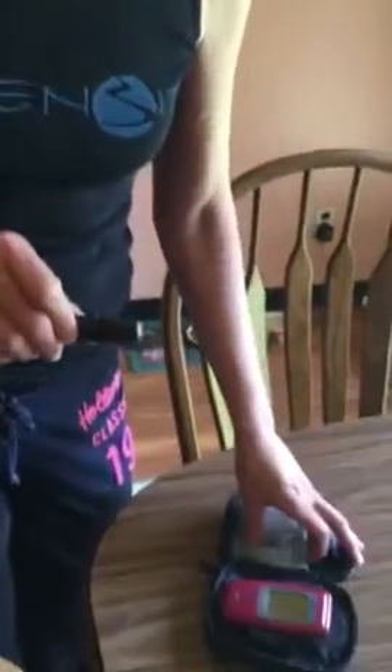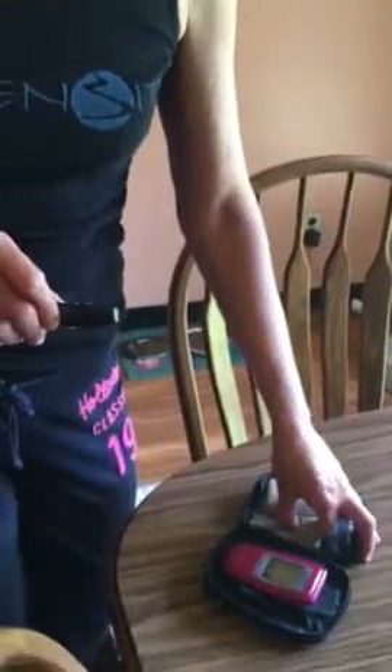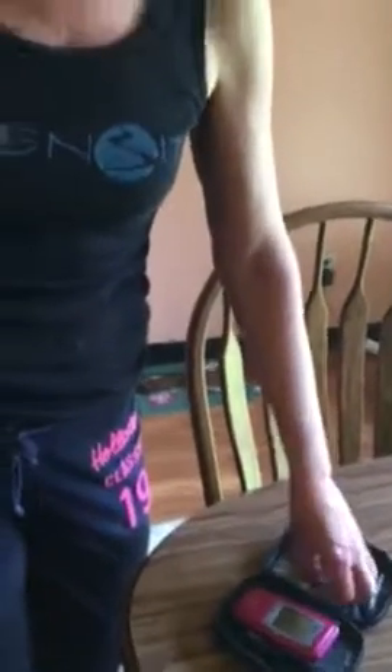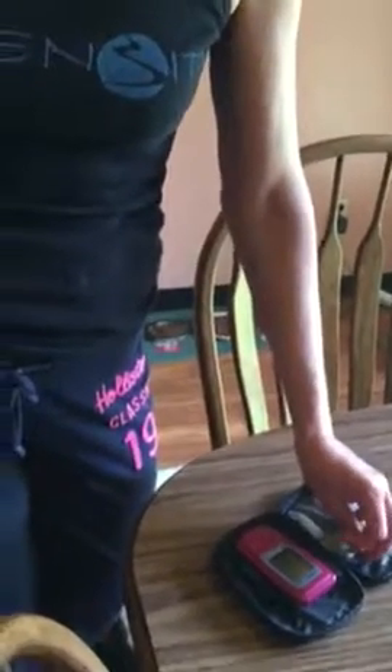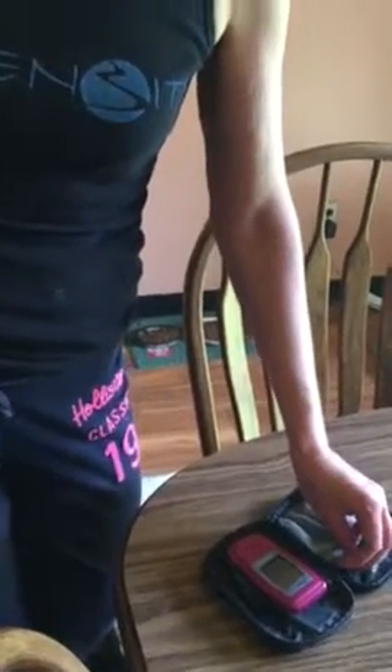I do use the ReliOn Confirm, and it is actually 40 points off of the vet. The whole point here is to catch trends and to prevent a hypo, so I just follow the instructions on tight regulation and how to prevent hypos, and I go by these numbers to tell me how she's doing.